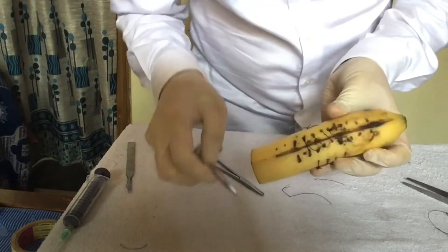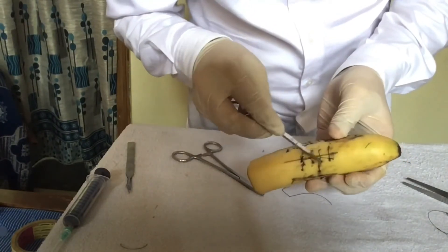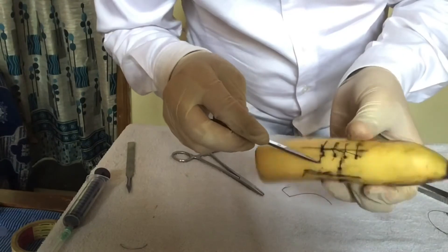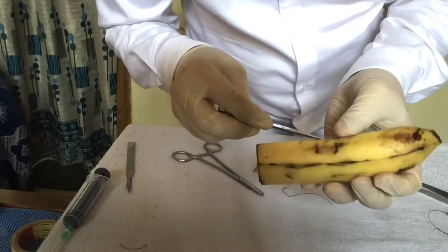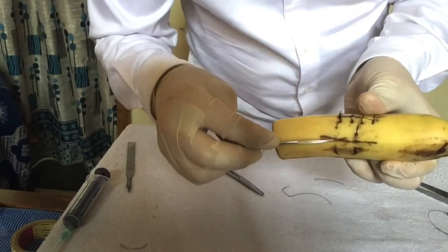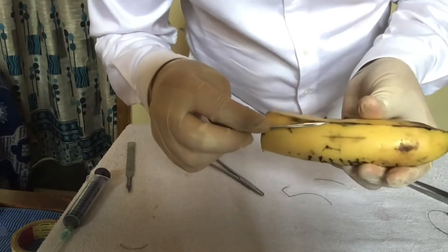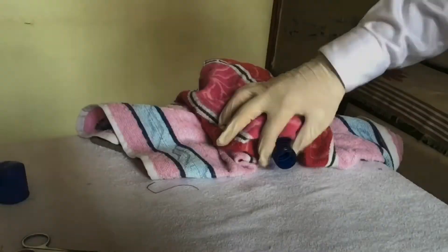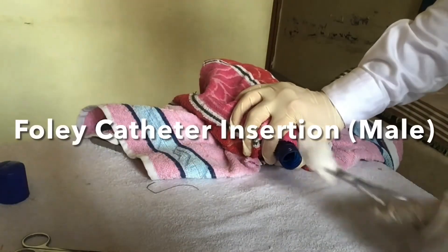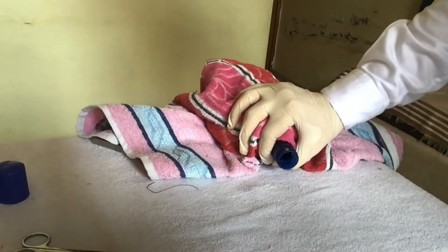This is continuous suture, this is continuous interlocking suture, this is vertical mattress suture, and this is horizontal mattress suture. For Foley catheter insertion, first of all use your non-dominant hand to hold the genitalia straight.